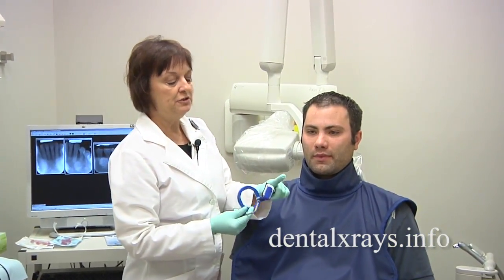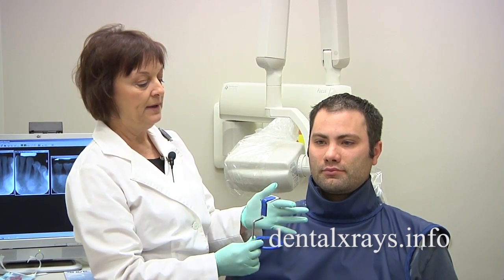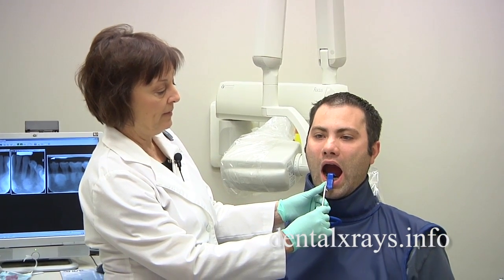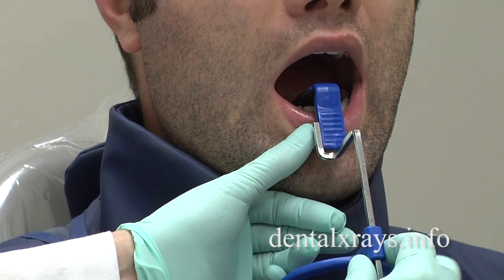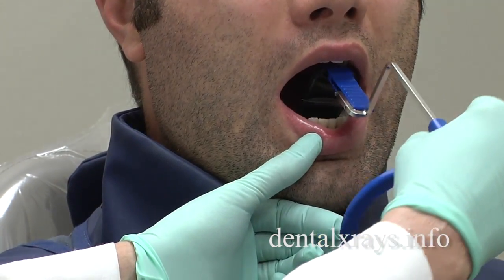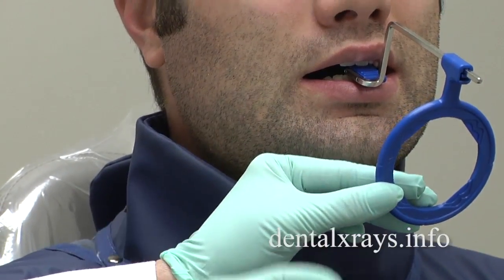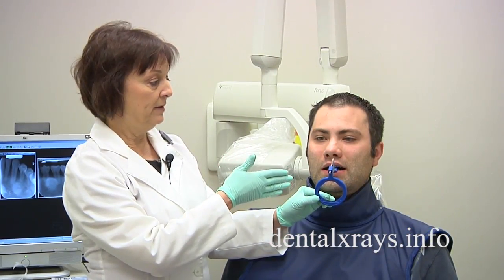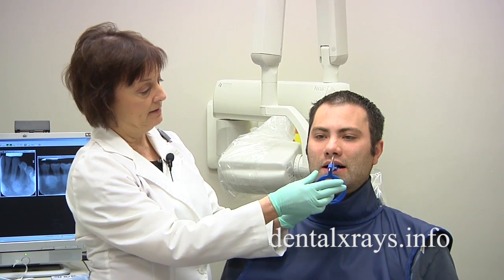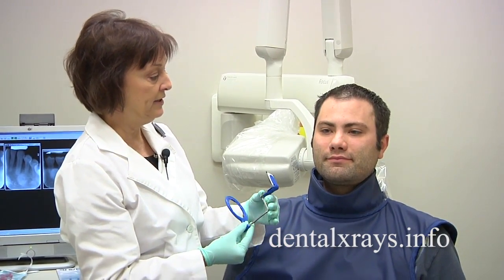Usually what you want to do is place the bottom edge of the film behind the tori and not on them. So this piece is going to be set a little bit farther back, depending on the size of those growths. Once you get behind them, raise the bar up and then have them gently bite down. This won't cause any pain, and you'll still be able to get the anterior teeth very nicely by putting it behind them instead of on top of them. It makes it a lot more comfortable for the patient.